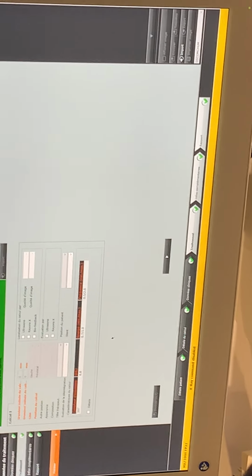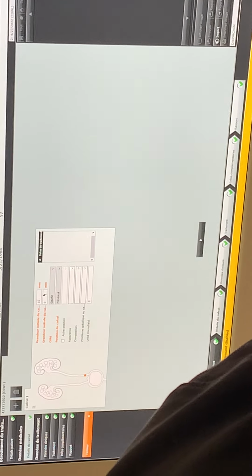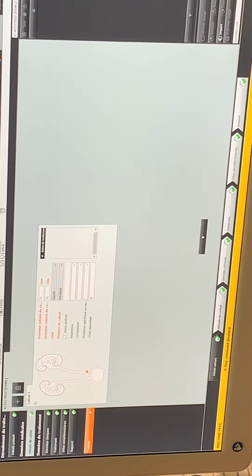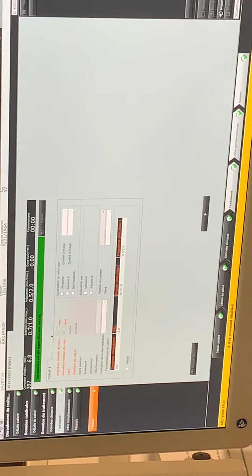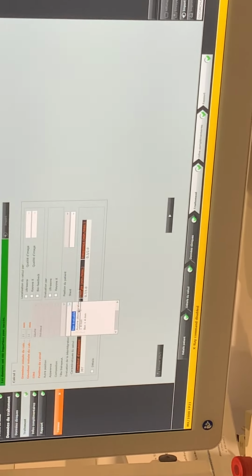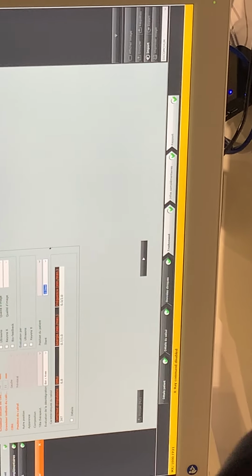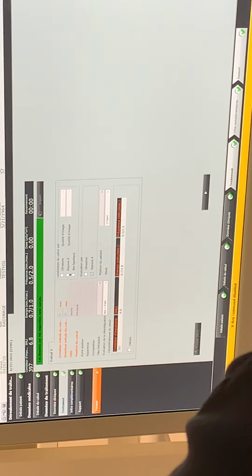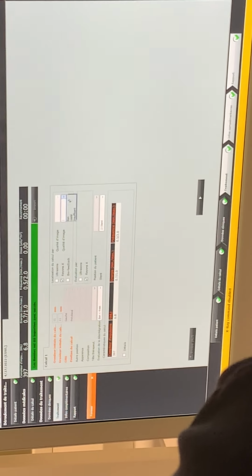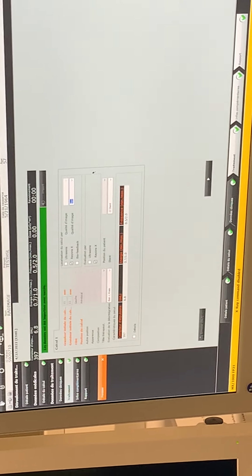Okay. So, let's enter some details of the stone. You can do it afterwards as well. Of course. See, now it's here inside. You can also say how was the evaluation of the disintegration. Was very good. Less than 4 millimeter. And I placed a JJ stent or was inside. I made the evaluation by X-ray and localization by X-ray. The image quality was nice. You can enter this information.